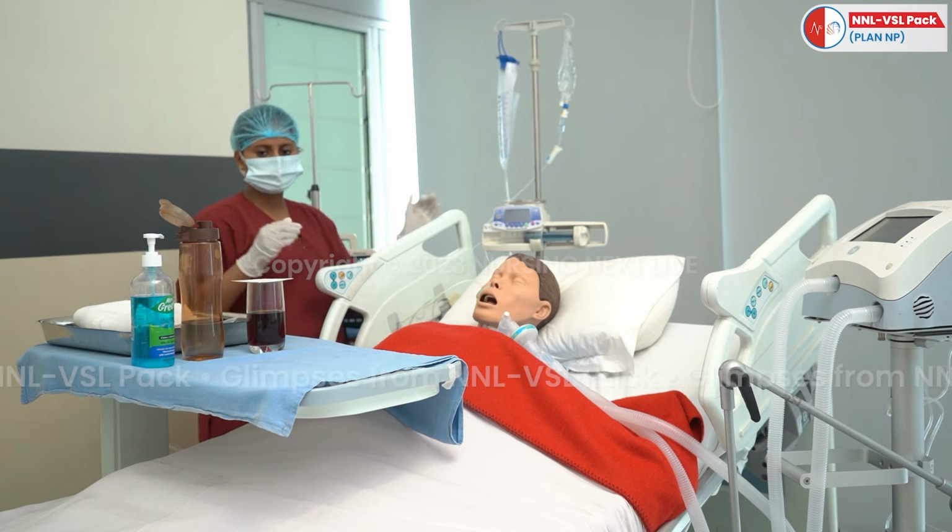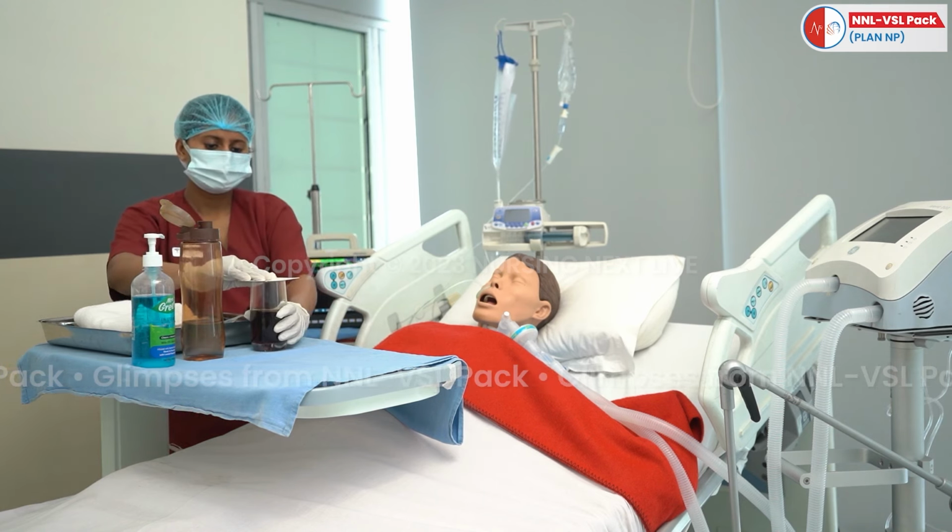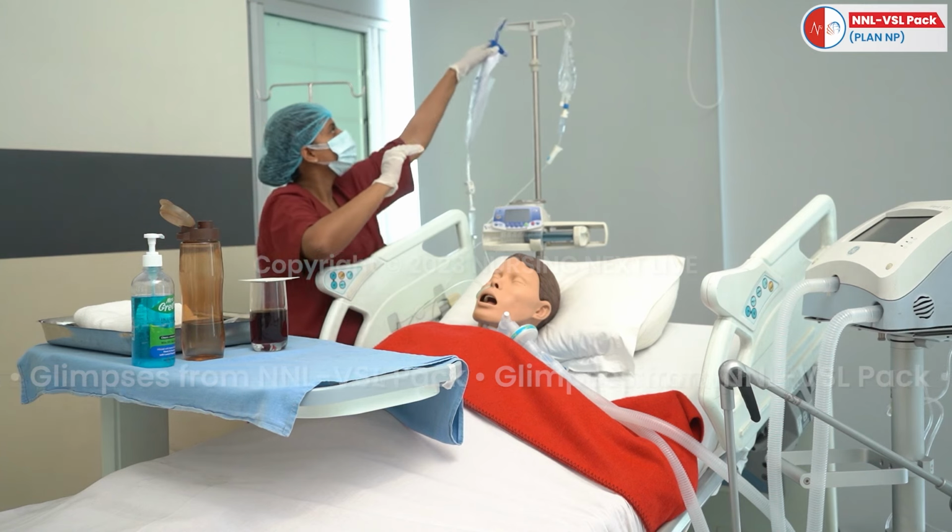Check the temperature and consistency of feeds and pour the recommended amount of feeds in the bag.